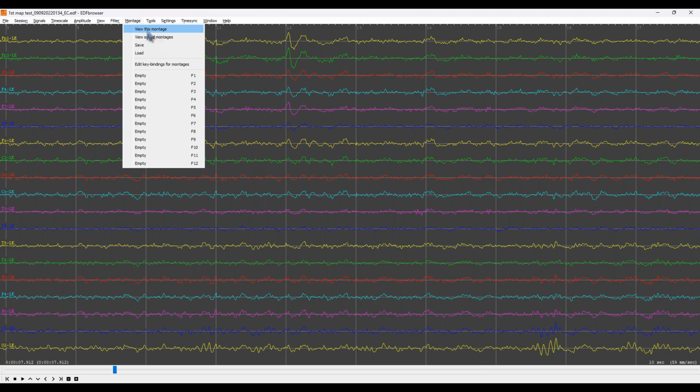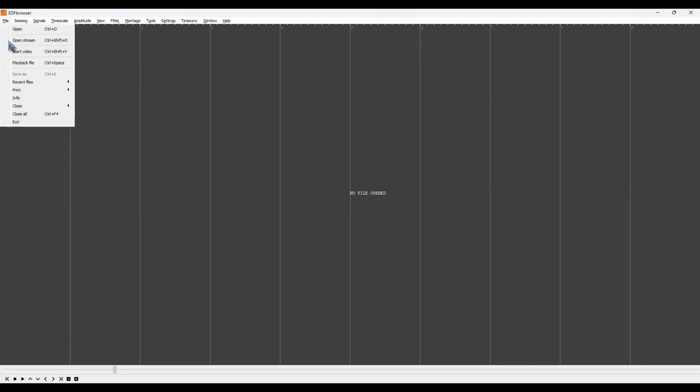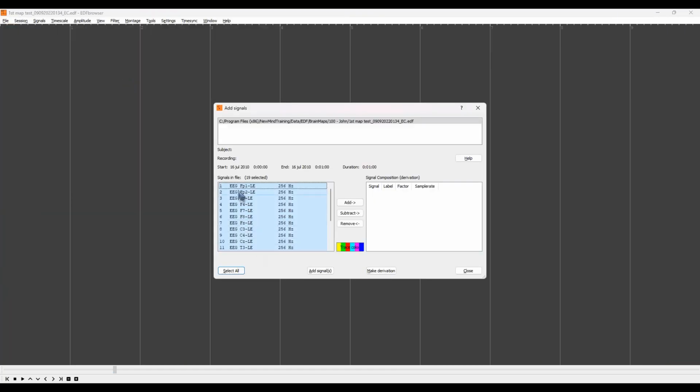Yes. And for those of you that aren't aware, Dr. Suter did a 2-part series specifically on artifact. Let's see if I can bring these up quick for you, just to show you where they're all at.